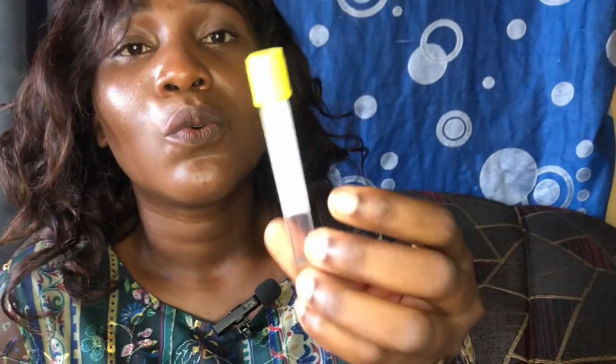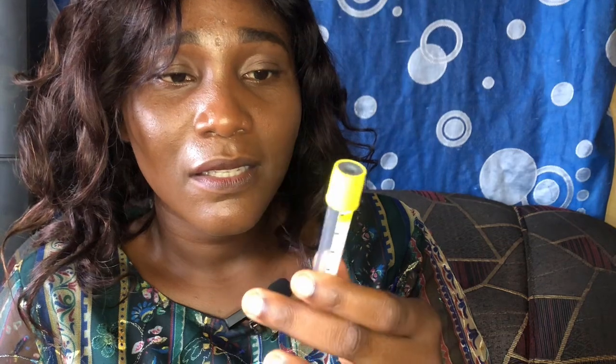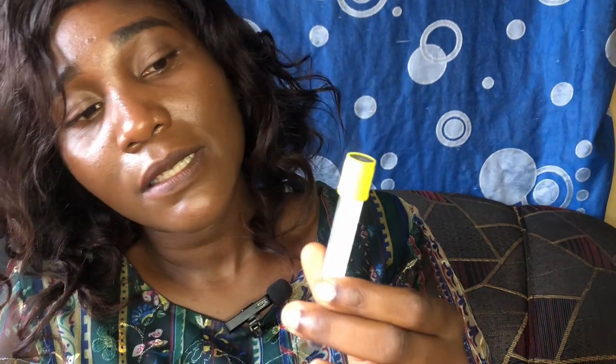Once you put in your blood sample and you allow it to stand, before you know it, the gel has separated. This is a serum separator tube. It has separated your serum from your blood immediately, naturally. This tube is not usually common in hospitals or labs. You only get it in a few standard labs, few standard hospitals.